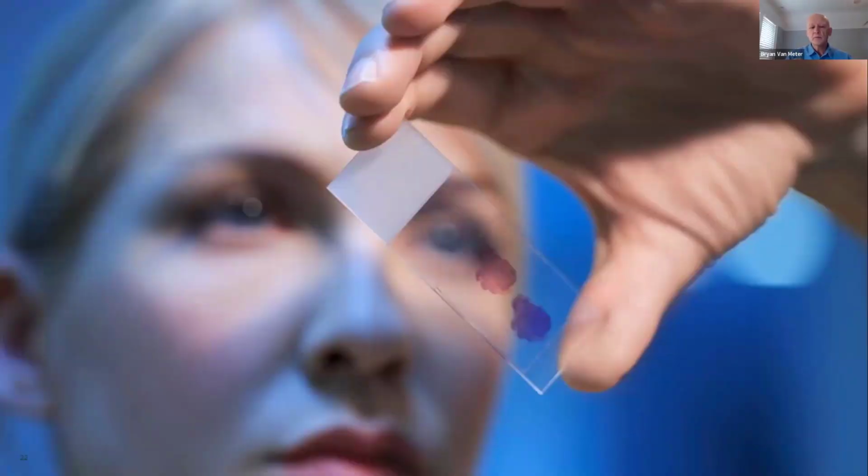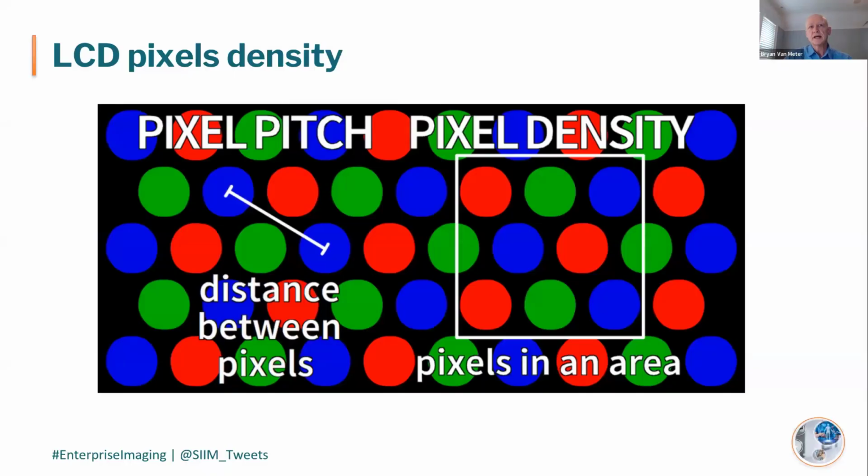One of the things when we moved into this field that we think is really important to maintain is, when you shift from analog to digital, what is the workflow? The first assessment of any slide before it goes into the microscope is just like this. This is the overview of the perception and the individual perception. The number of pixels available on the screen and the distribution of those pixels will determine how well this first step in digital pathology diagnosis is launched. And that begins with a discussion about pixels.